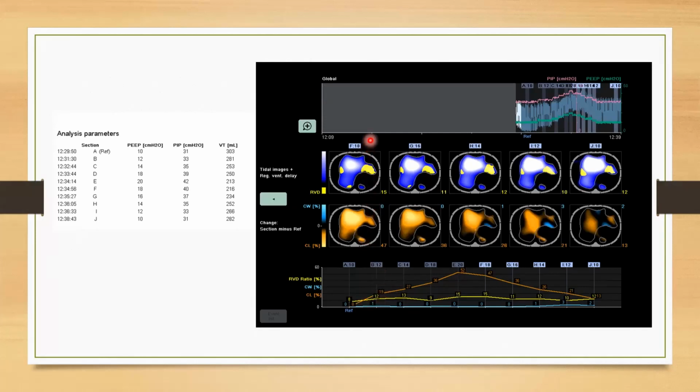And that's the issue also with some of the doctors that want to use the ARDSnet, where there's a PEEP adjustment based on FiO2, which is really not individualized to the patient. So this patient had higher FiO2s. If we would have tried to just place the PEEP based on FiO2, we would have done considerable harm probably here. So you see that the loss of compliance is all throughout the lung. So the best PEEP actually is 10.